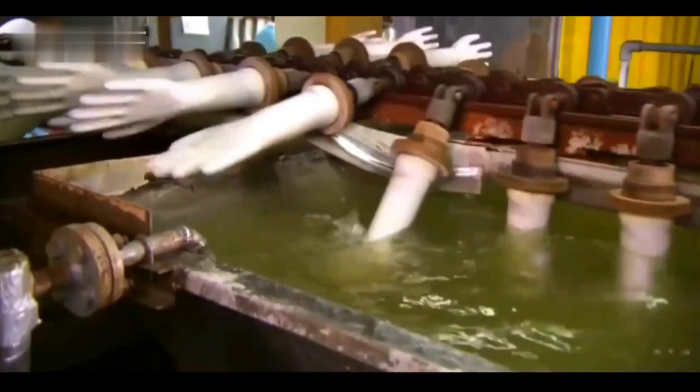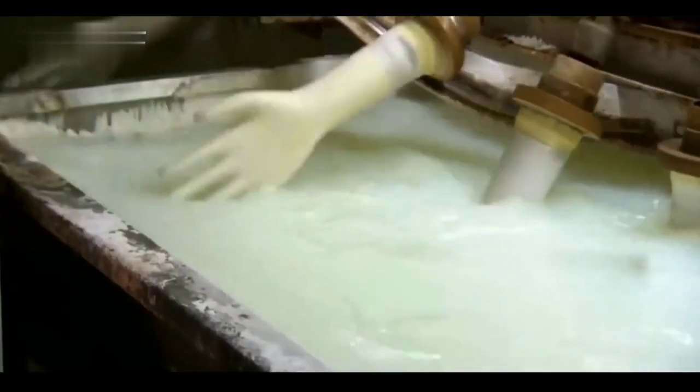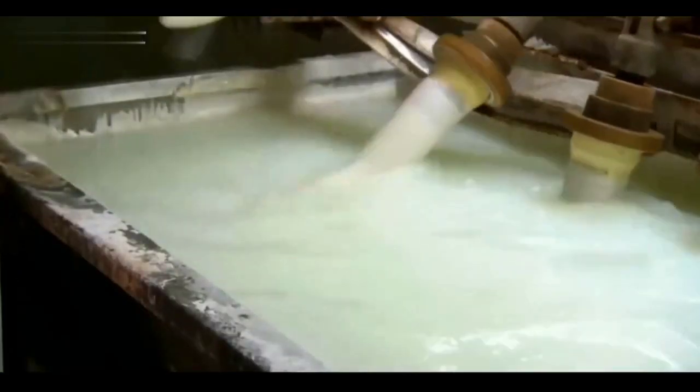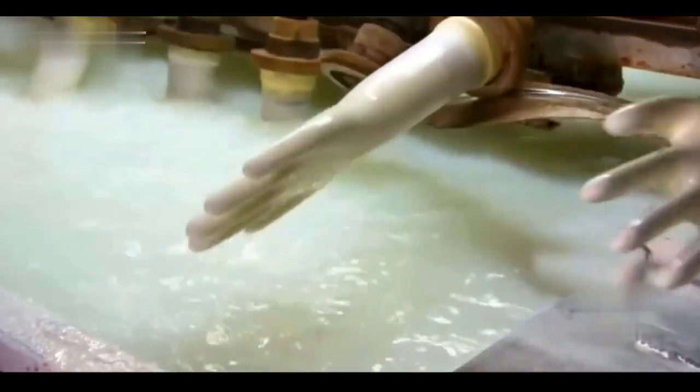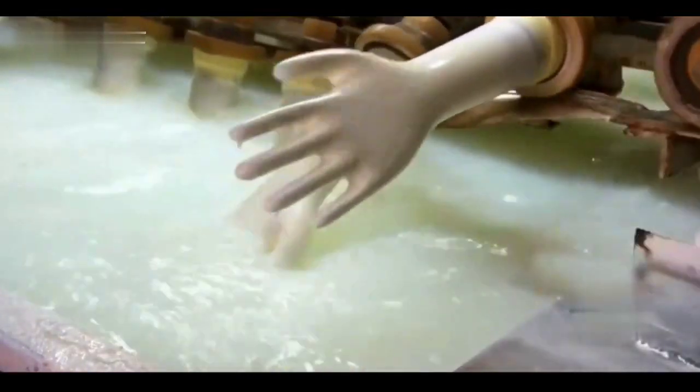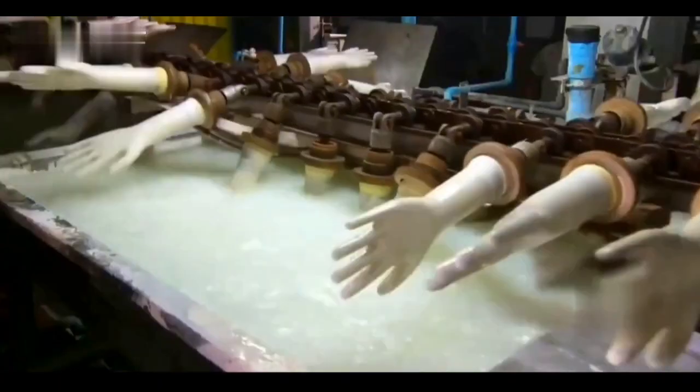These ceramic glove molds are soaked and cleaned one by one in soapy water, then transported to a bleach bath to remove each spot. This is a factory that makes medical rubber gloves. The molds need to be thoroughly cleaned before they are used, and any impurities left behind could cause the gloves to break.